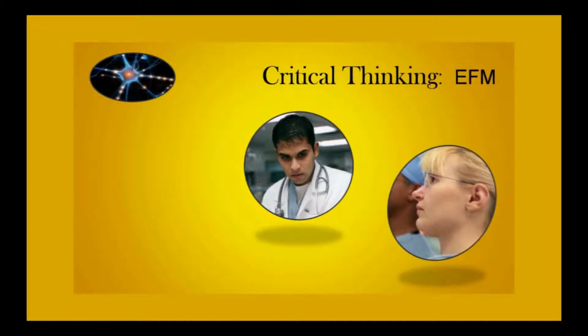Hey, I just got here. I didn't turn it off. I'm sure the other nurse probably had a good reason to do so, but you'd have to check with her instead of me. Maybe the repetitive decelerations and poor variability had something to do with it, but that's just me.